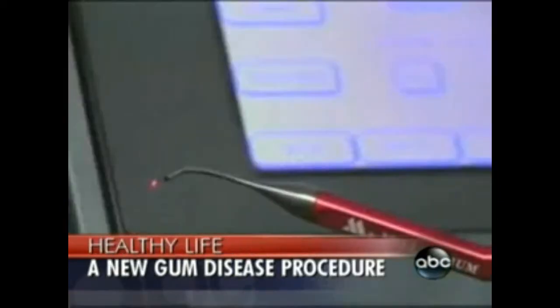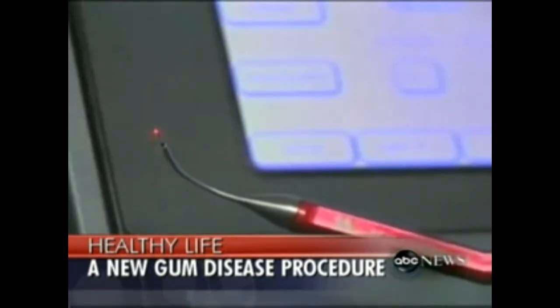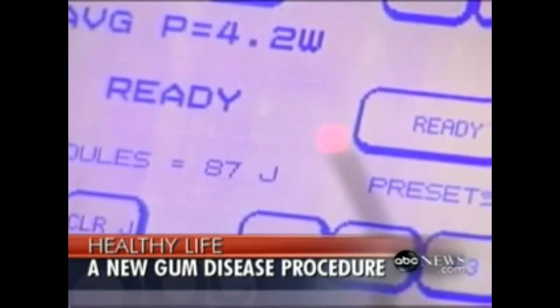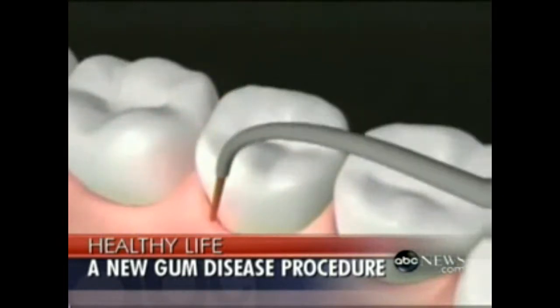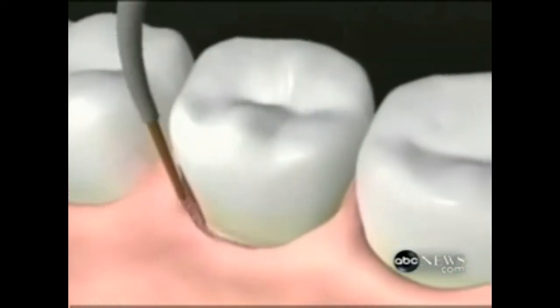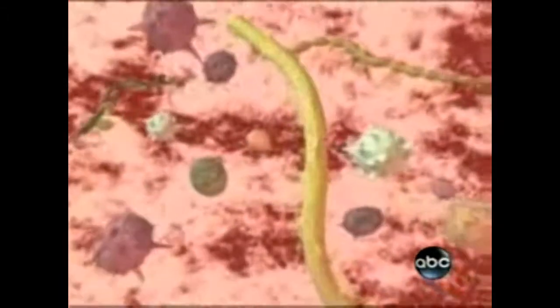Laser-assisted new attachment procedure, also known as LANAP, is a means to treat gum disease using a laser versus scalpel and suture surgery. After a proper periodontal diagnosis with x-rays and periodontal chartings, we use the laser to gently pass between the gums. It's a very tiny fiber optic, about 3 human hairs, to vaporize the disease and leave the otherwise healthy tissue structures in place. We use ultrasonic root debridement, root cleaning devices to clean the root surface. And then we use another setting on the laser to clot the blood so that we get a seal, so we don't have to use sutures. About half of the mouth is treated at a given point in time, and then 1 week later the other half is treated. Two-hour visits.